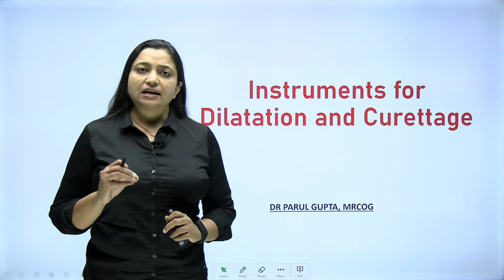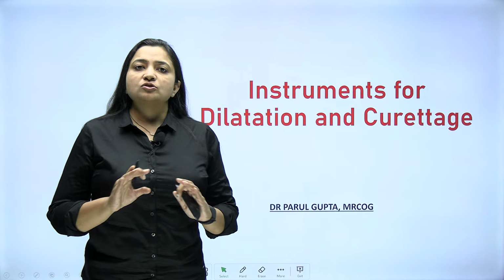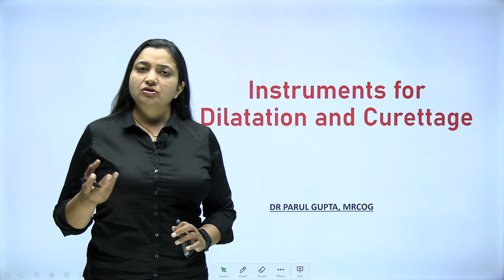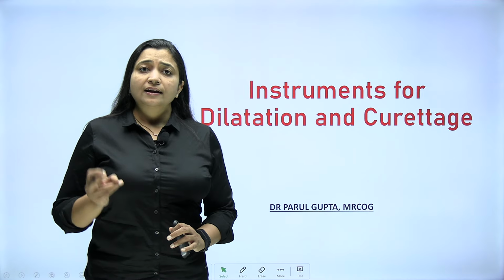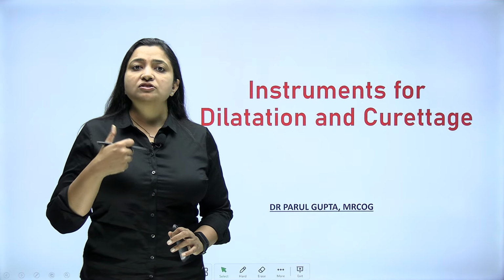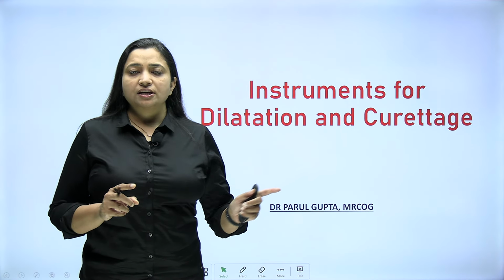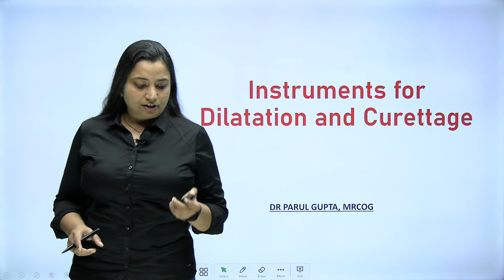Dilatation and curettage is a gynecology procedure where there is no pregnancy. We want to just curette, to scrape the uterine walls and take out the material either for histopathology or some other procedure, like you want to see the menstrual phase. But dilatation and evacuation, the word evacuation means to take out products of conception. There is something related to obstetrics. So, this is the difference. D and C is gynecology, D and E is obstetrics. Okay. So, we will start with the lecture on instruments.